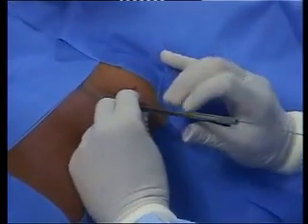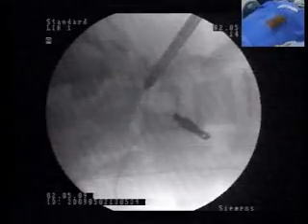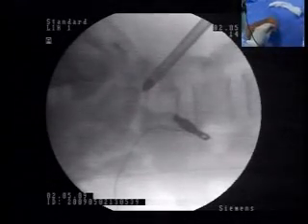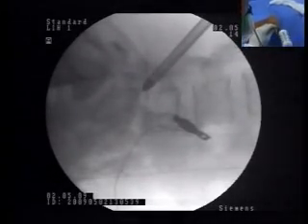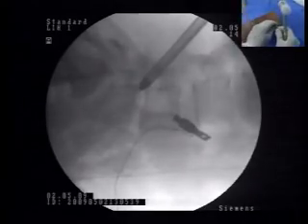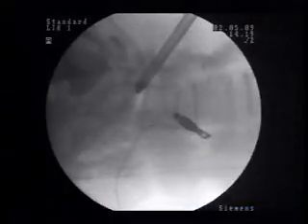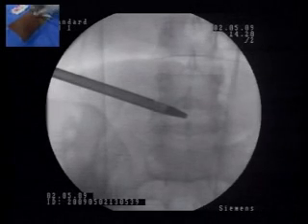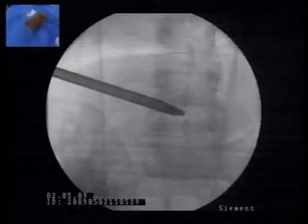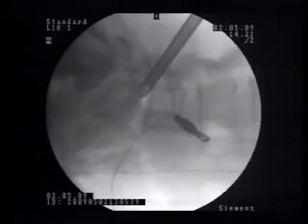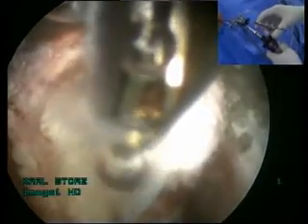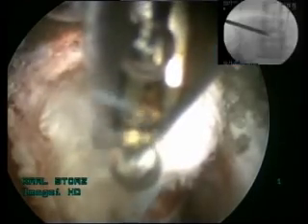We pass a dilator after incising the skin and maneuver it to position it exactly in the foramen next to the fragment. The fragment has two components: one intradiscal and one extradiscal portion. The dilator is gently tapped at the base of the herniation intradiscally and lies below the fragment. A cannula is then passed over the dilator and positioned so we can grab the fragment from the intradiscal side. The cannula position is confirmed on lateral C-arm X-ray, and the fragment is visible directly once the scope is introduced.